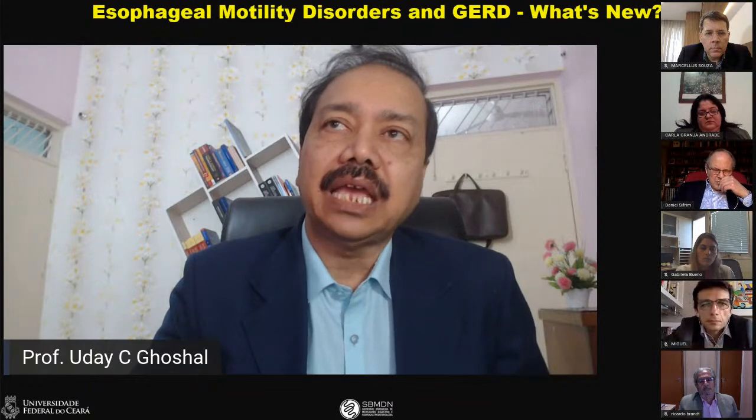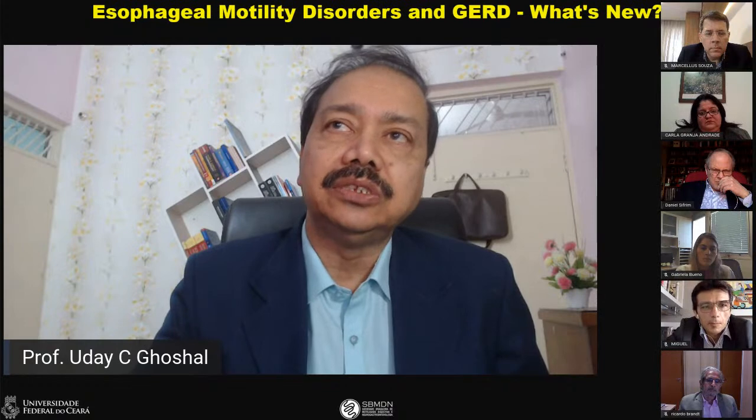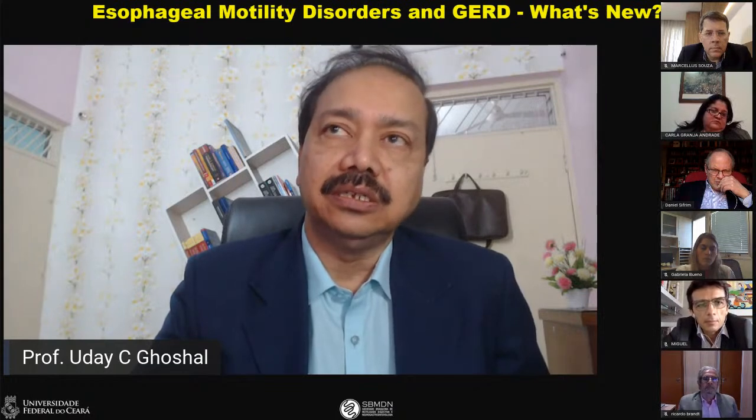So what is your thought about this: could there be changes in the nerve supply to the fundus and therefore fundic relaxation, and the capacity of the stomach which got reduced, leading to an increase in the intragastric pressure during multiple rapid swallows, and therefore that could have led to a change in the esophageal manometry parameters following the surgery?